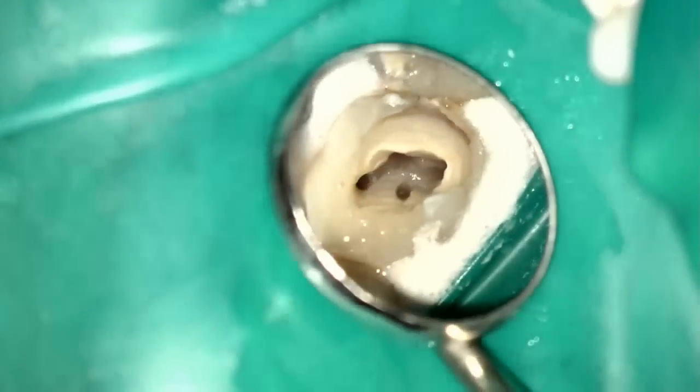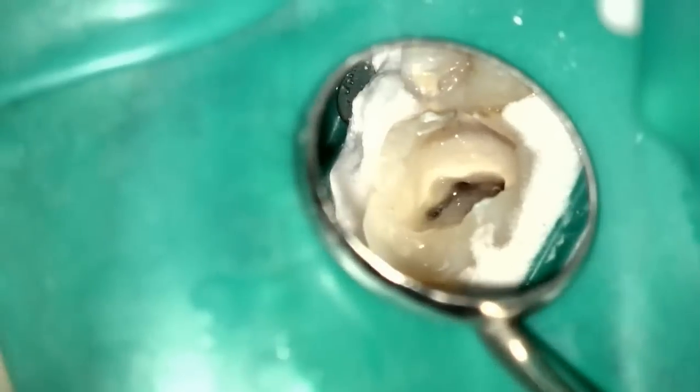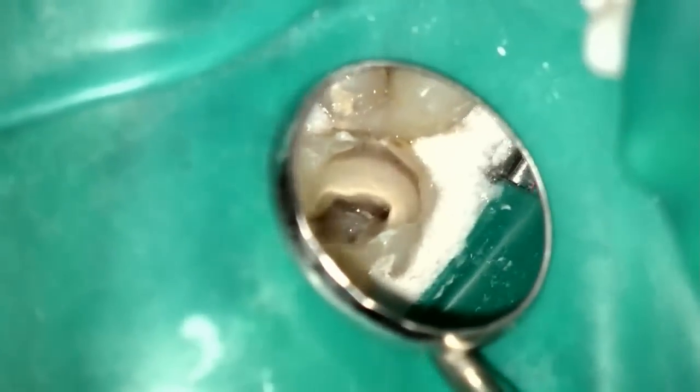With my microsuction you can make it nice and dry, and you can really get the sense that the access is starting to develop into its final shape. You can see how the canal orifices are starting to develop. Now is when I take my final working length and proceed with the 1504 again — I go up, I don't crown down. It's just the way I do it. I'm not sure how I ended up doing it this way, but it works better in my hands. Some people crown down; I do a step-back crown-down hybrid, and I find that to be very efficacious.